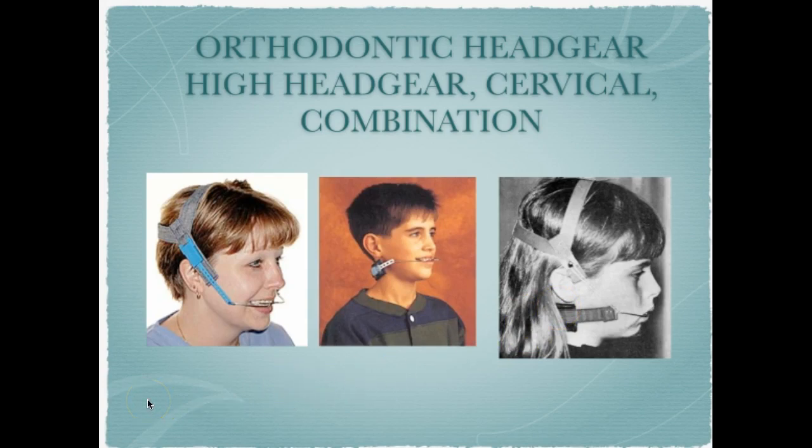These appliances have a wire that is inserted into the orthodontic tube holder, where the wire holder is on an orthodontic bracket or a band, and then the head strap or the neck strap or both create additional pressure either to stabilize the maxilla or to move teeth distally, and certainly the orthodontist will determine what is best for the particular patient.